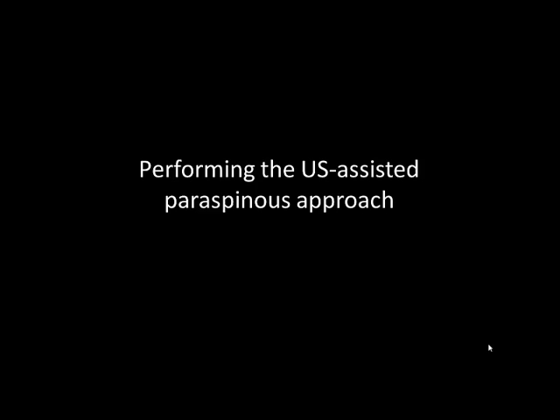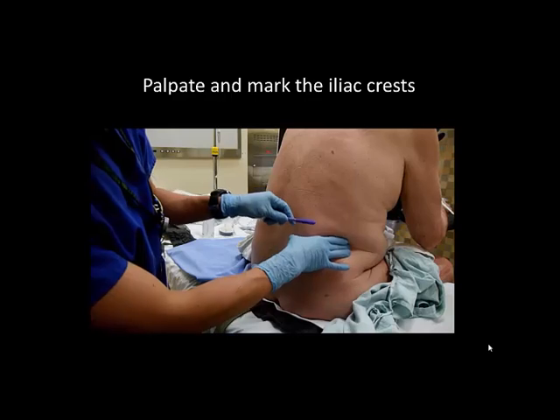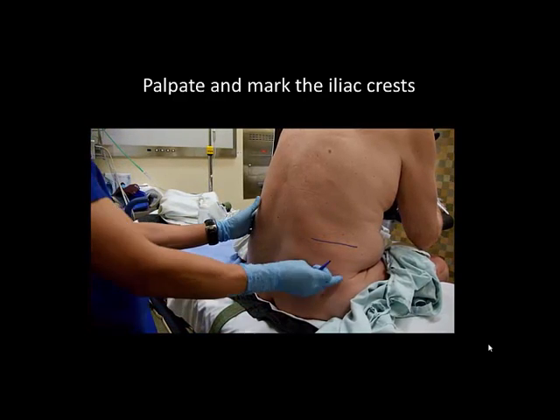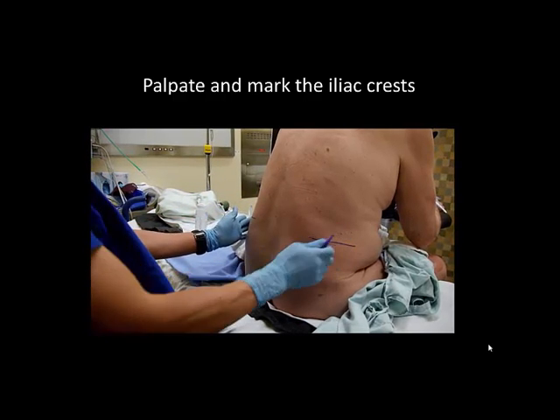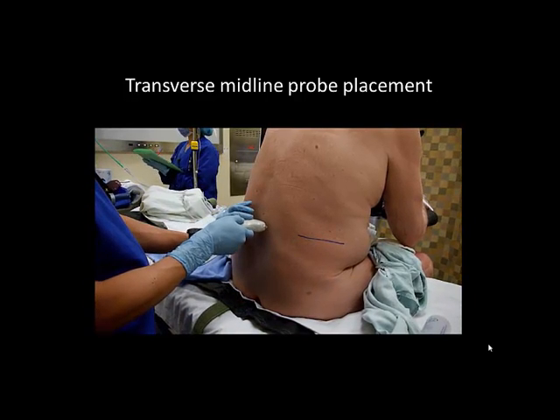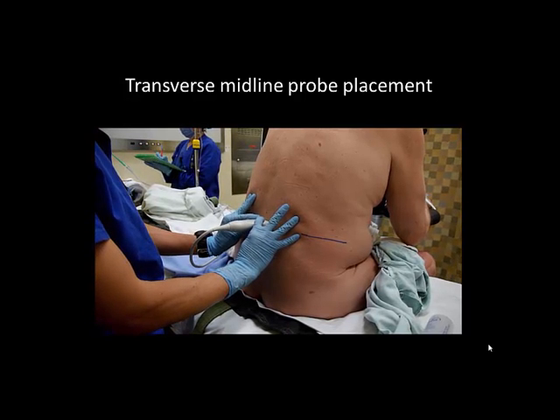The ultrasound-assisted paraspinous approach to lumbar neuraxial block is performed as follows. The patient is appropriately positioned and the top of the iliac crests are palpated and marked to indicate the approximate position of the L3-4 intervertebral space. The probe is placed on the patient's back in a transverse orientation over the midline and slid in a cephalad or caudal direction.